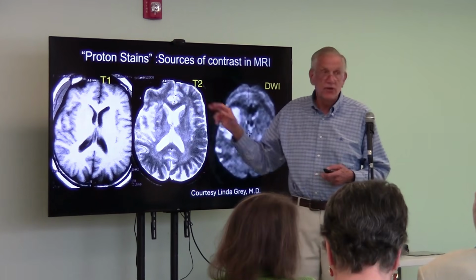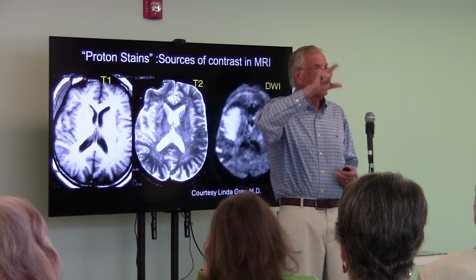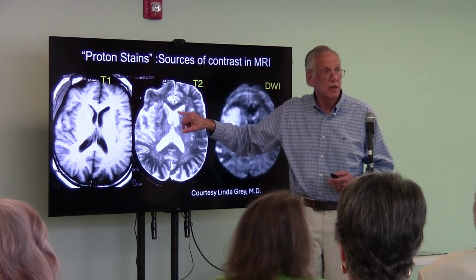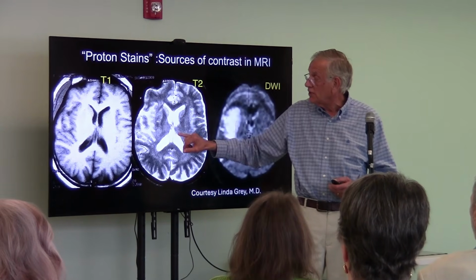So here's the T2. You excite the tissue, and the signal rings for a long time. And the more rapidly it decays, the shorter its ring time, the shorter the T2. So water that had a very long T1 and was black has a very long T2 and is white.